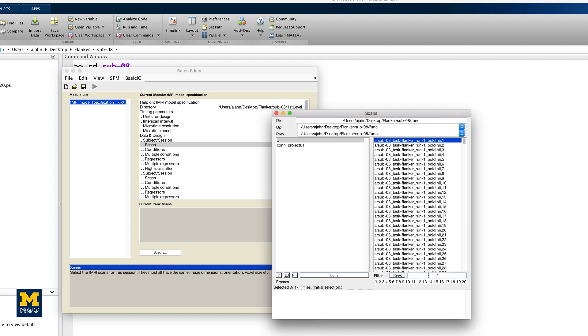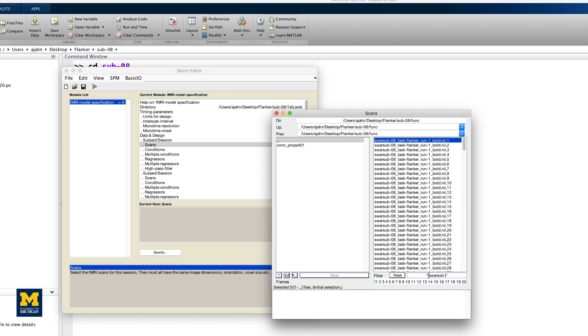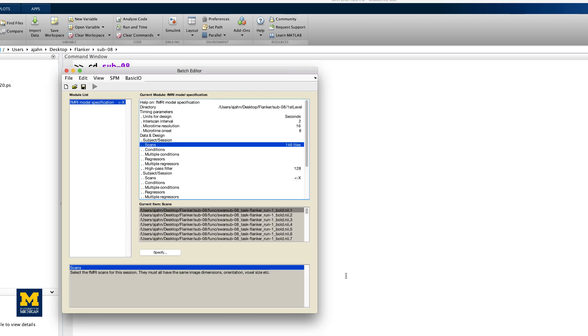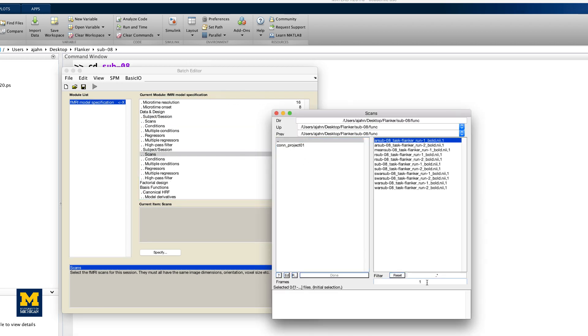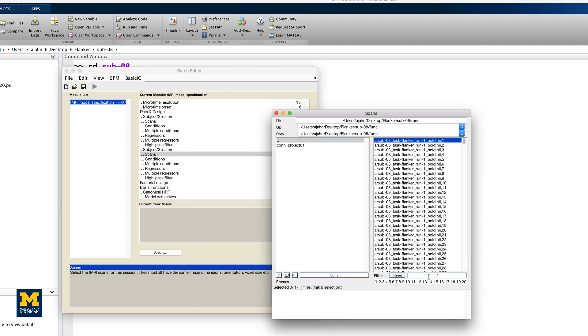In other words, those files beginning with the string SWAR. Do the same for the volumes in the second session.